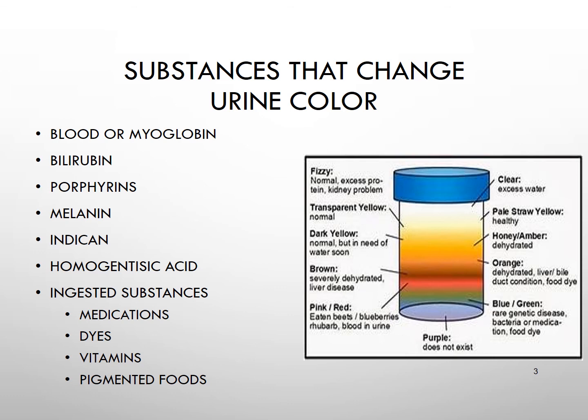So if you have a patient with a normal urine, but when you do the chemical process you see large amounts of glucose, that can definitely indicate some kind of pathological process. But in contrast, if you have a red urine, this is often an indicator of blood, and can result from the ingestion of beets. Okay, so nevertheless, urine color is a valuable preliminary assessment of a specimen. Many substances really are capable of modifying this color.